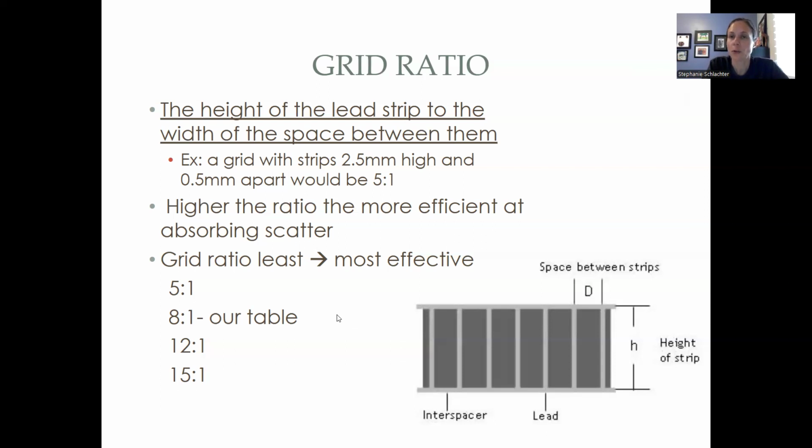Like I said, the higher the grid ratio, the more efficient or effective, like better quality our image is going to be.